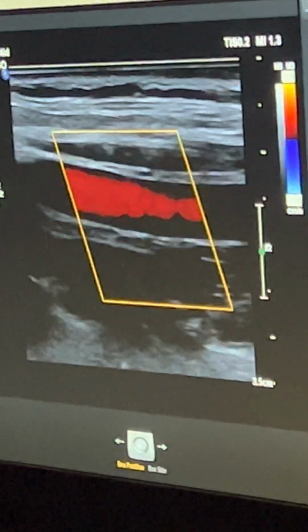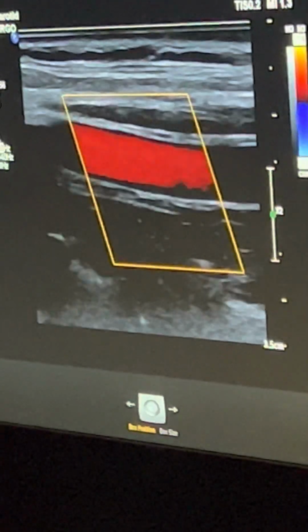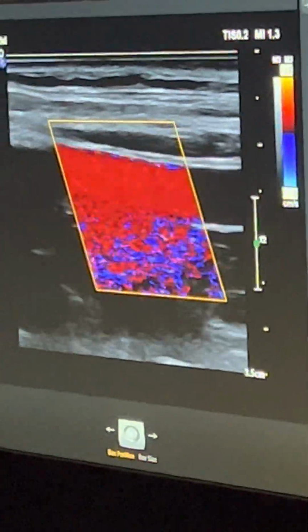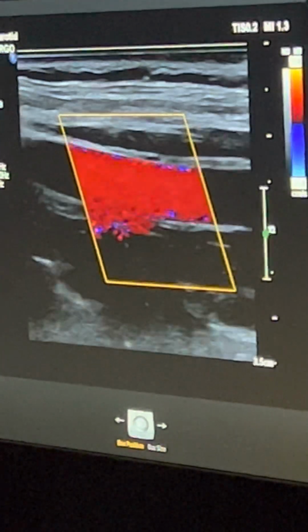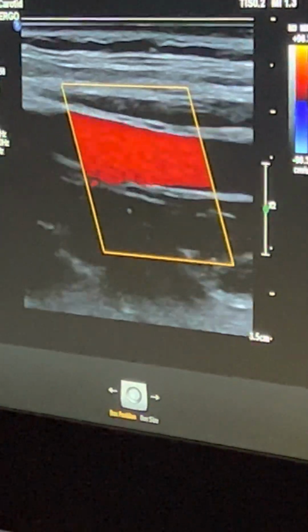Cool. So I dropped my scale. What do we tell you about turning up your velocity's color gain till you see speckling and then back it off? That's the only way you're gonna know that you have your color gain set correctly. So, a lot of mosaic going on. I turned it up so I could fill, and I started speckling. I turned it down, the speckle goes away, I'm still not filling.